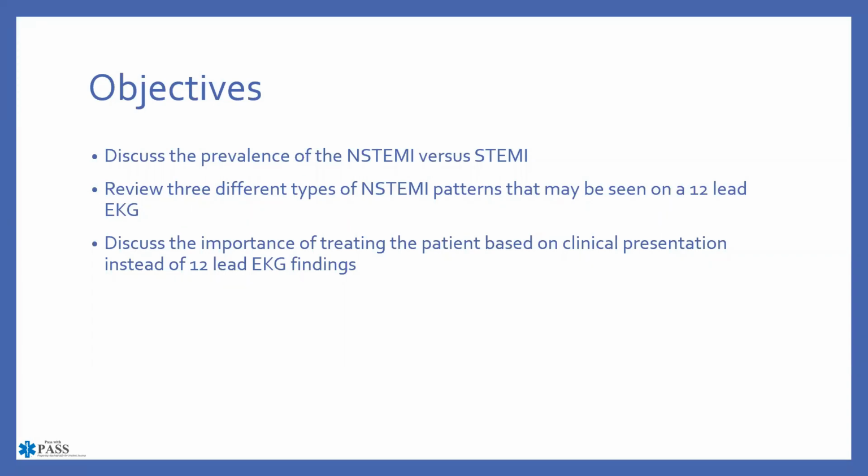And, back to EMS initial education, it's always been treat the patient, not the monitor. So if we can do that in some of these situations, if the patient is in fact having chest pain or they're displaying signs and symptoms of an acute coronary syndrome, then we may be of benefit to them. And I think that it'll be eye-opening to you, especially when we get into Wellens syndrome, on why it is important for us to have an initial EKG, a repeat EKG, and then ultimately the emergency department or the intensive care unit or wherever they're being admitted, they need to continue doing serial EKGs, and we'll show you why that is important here in a few.